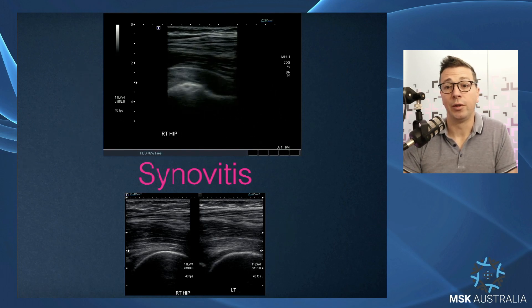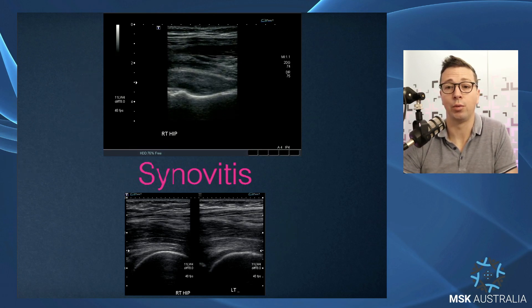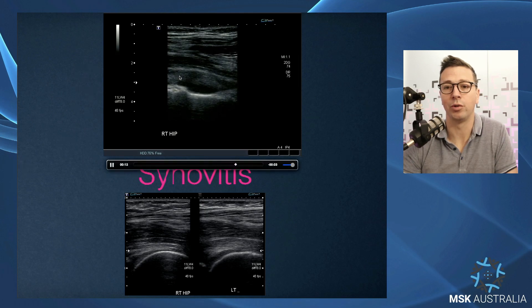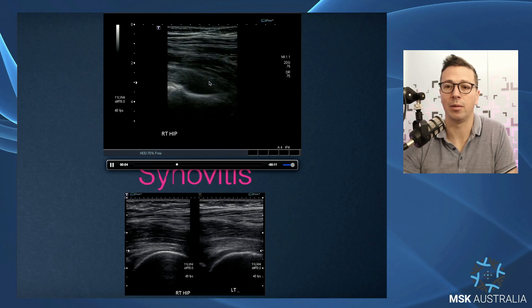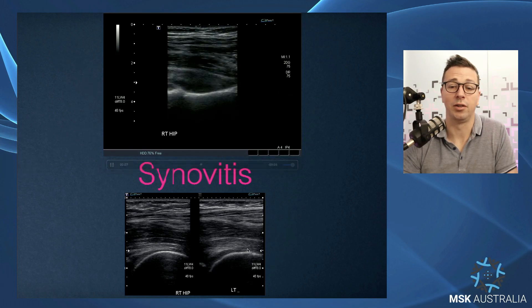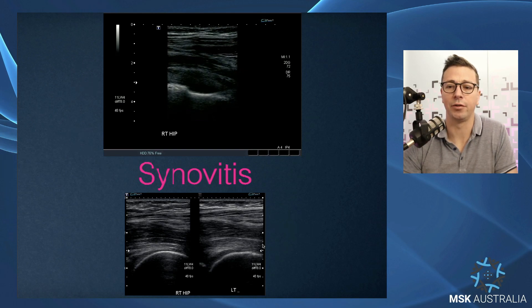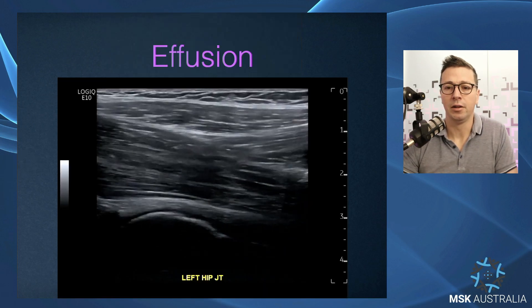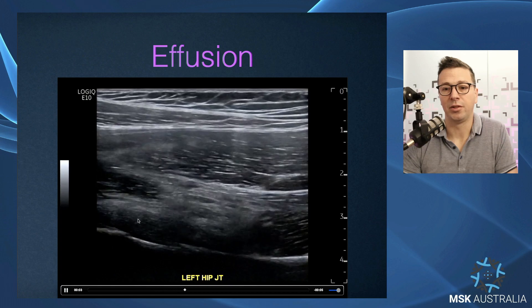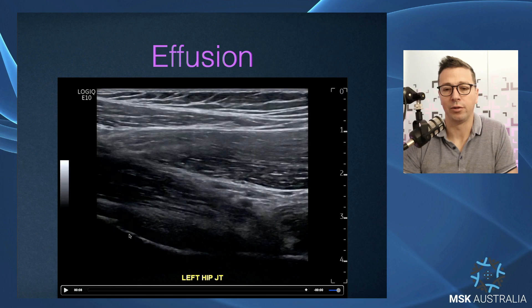Stepping away from that, the other pathologies we can see are secondary signs of osteoarthritis: synovitis, so the joint capsule is thick, edematous, with a small amount of fluid. We see very thick hip joint capsule. If you're unsure, comparison to the other side is quite easy to do. We also see hip joint effusions — these can be just small trace amounts of fluid within the joint.